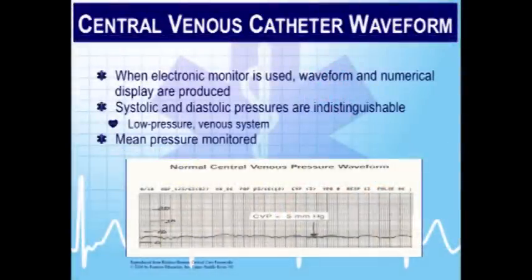That's what a normal central venous pressure waveform looks like. It has little undulations in it. Those little undulations are actually something, and I would not expect to just see a CVP going across flat line on the screen. I would question the patency of the line if I didn't see those little jiggles. Those little jiggles, if I line them up to the patient's EKG, are the contraction of the atrium, the closure of the tricuspid valve, and the squeezing of the ventricle against the closed valve. The valve bulges back and makes the pressure go a little bit higher. All right? That's what all those little undulations are.